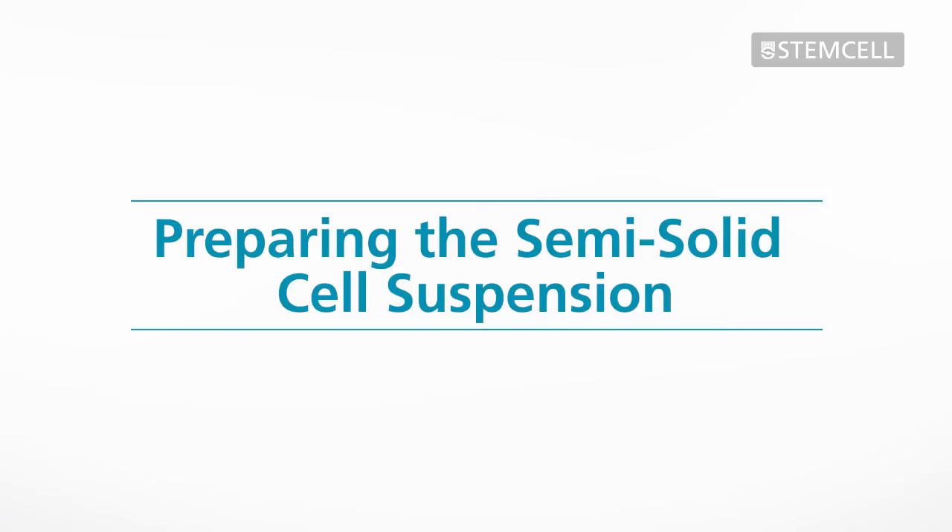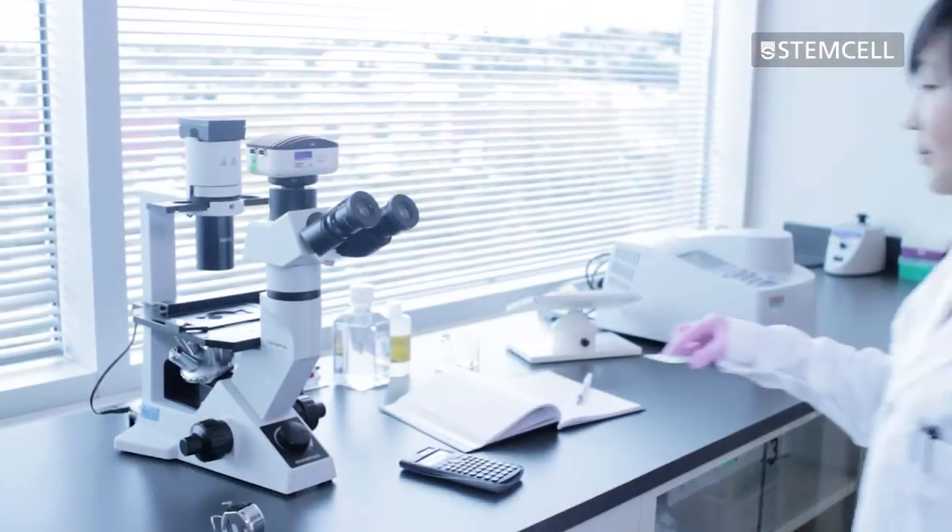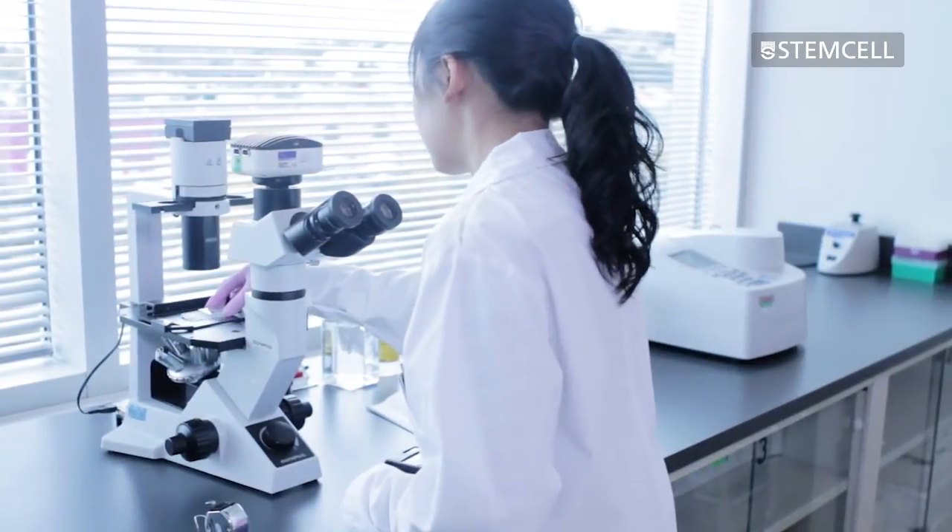Preparing the semi-solid cell suspension. To prepare the cells for semi-solid cloning, remove the transfected cells from the incubator. Cells can either be harvested by centrifugation or transferred directly from the culture flask. Regardless of which method is used, they must be in a single cell suspension.